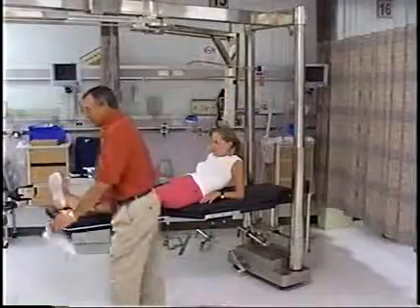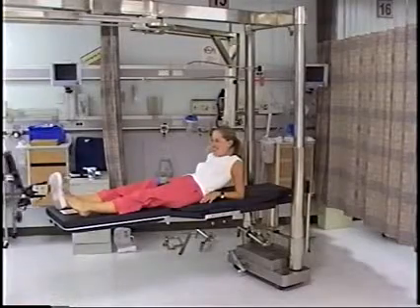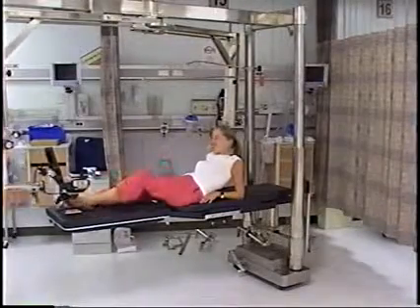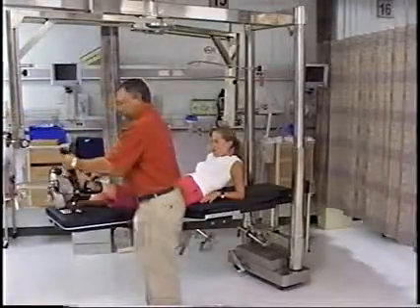Once we've done that, then you'll notice that we're going to have to move this in, and her leg goes up in the traction.